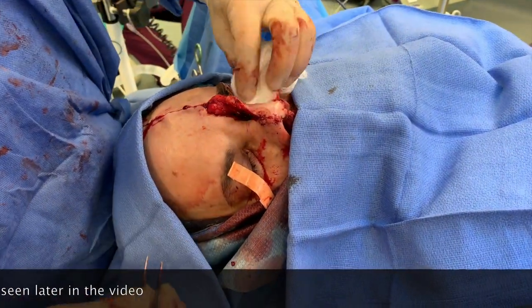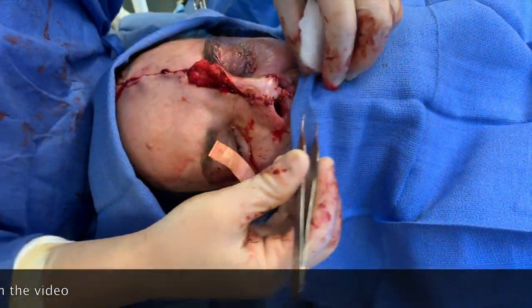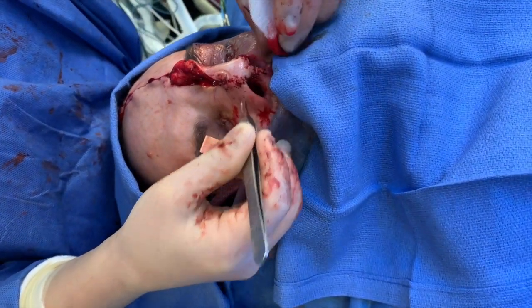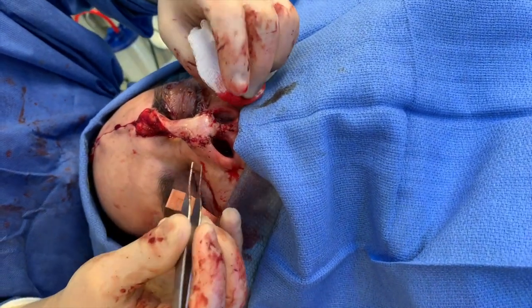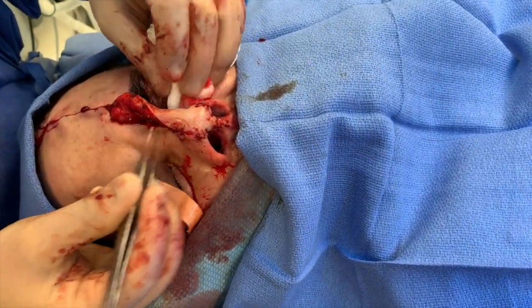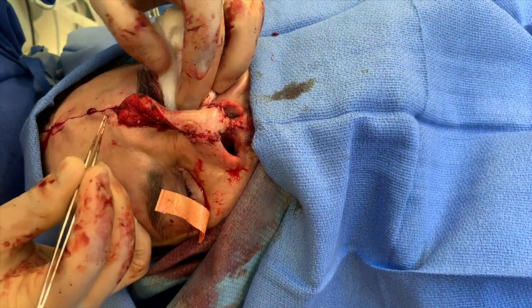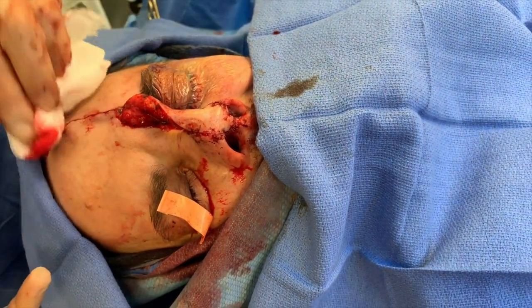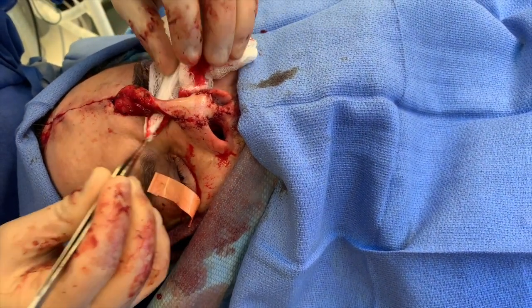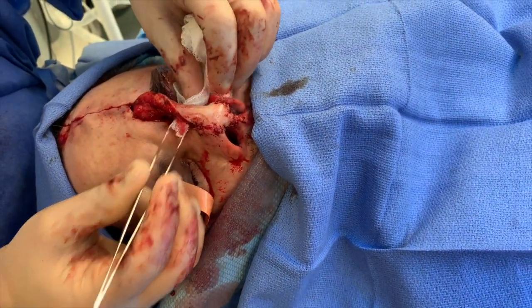You can see that the flap is inset. We've recreated his nostrils — they're a little bit distorted now, but that's basically because this is being pulled. We have the cartilage graft to support everything. You can see we've closed up the forehead, and in about three weeks we're going to undo all of this and give a final result.